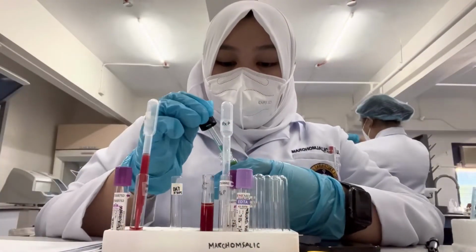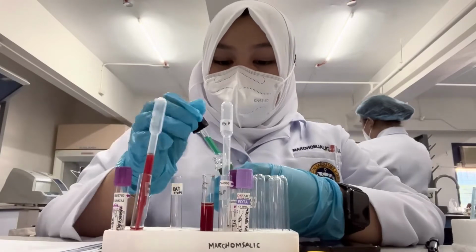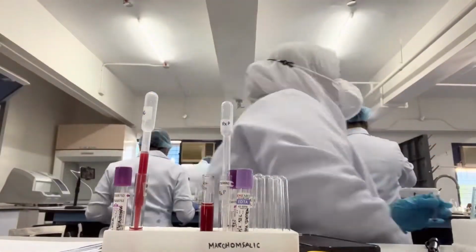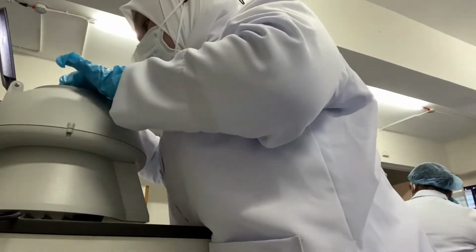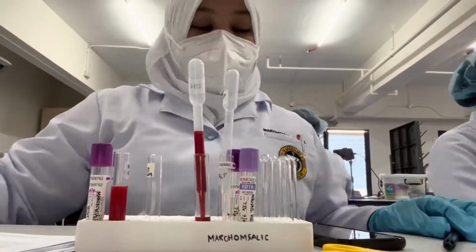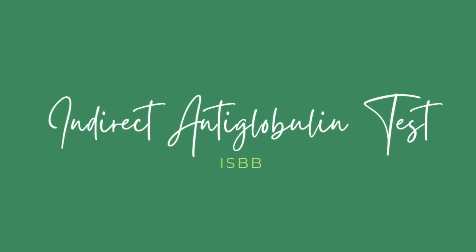Fifth, add 1 drop of anti-human globulin to the cell suspension. Sixth, centrifuge for 30 seconds at 3,400 RPM. Examine the cell for agglutination, grade, and record. The eighth procedure is indirect antiglobulin test procedure.